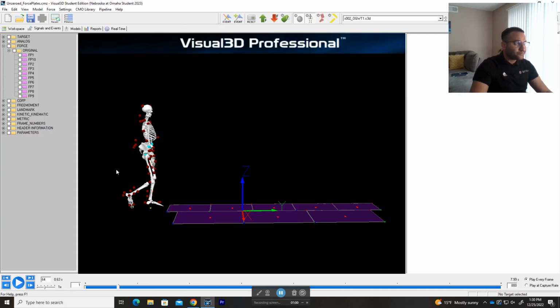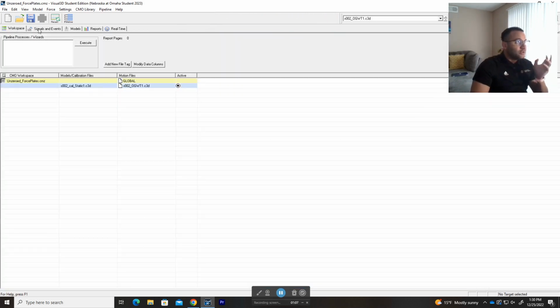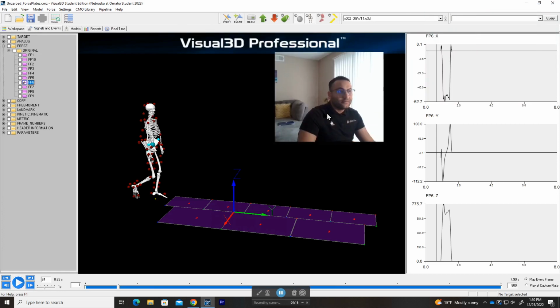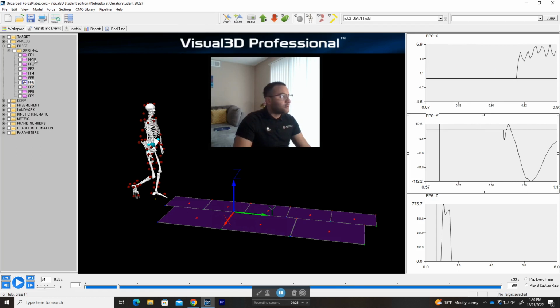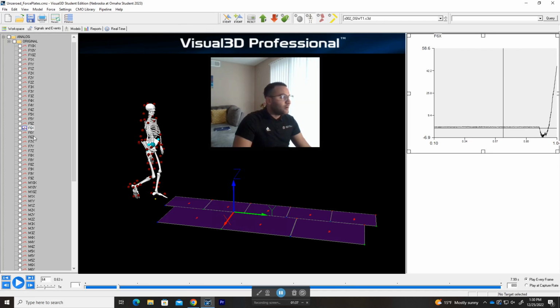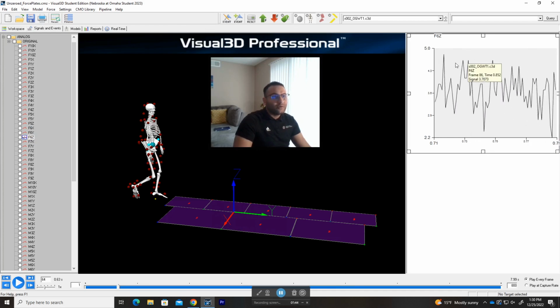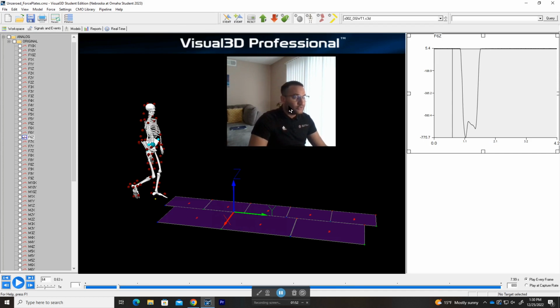So when you face this problem, I basically exported everything in this workspace, and I'll provide this workspace. It's the same trial here, and if we present force plate 6 here, you don't see it perfectly in the force plates, but you'll see it more in here. For F6X, you see that it's a little bit above the 0, so it's not zeroed, as you can see.